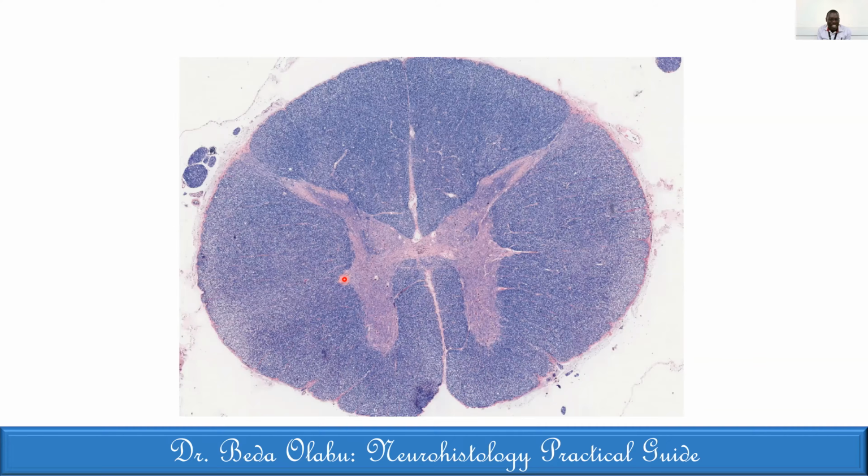Very unlikely that it will also be an L1 and L2, because those ones also give you plexuses. So we are remaining either between T2 up to T12, or we are remaining the possibility of an S3, perhaps.